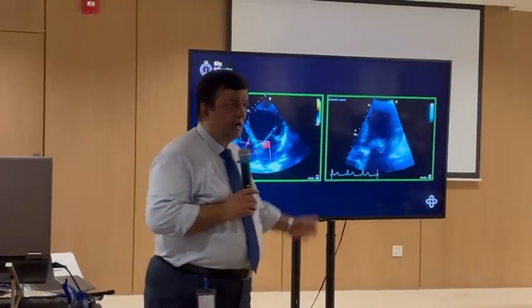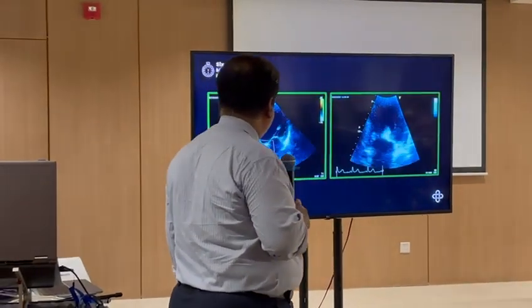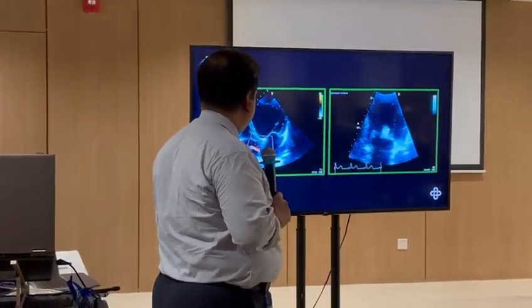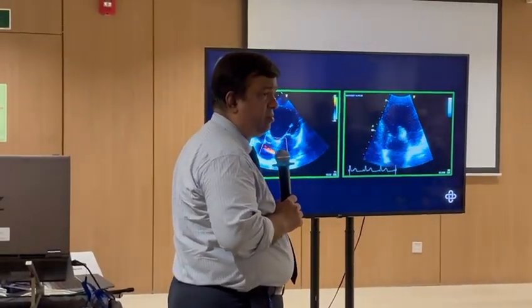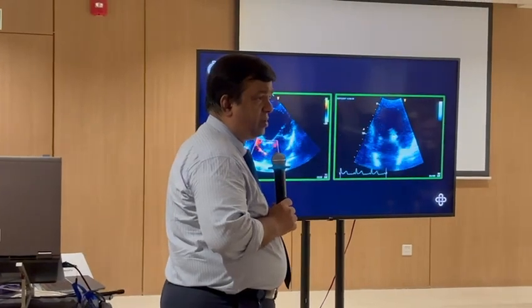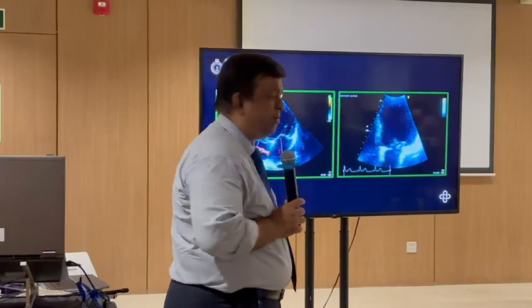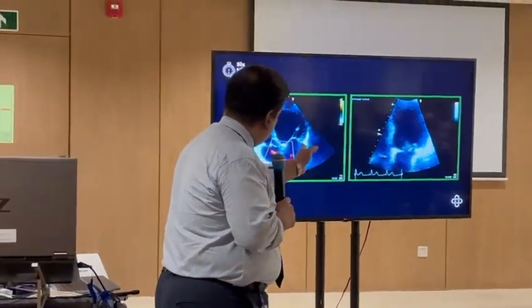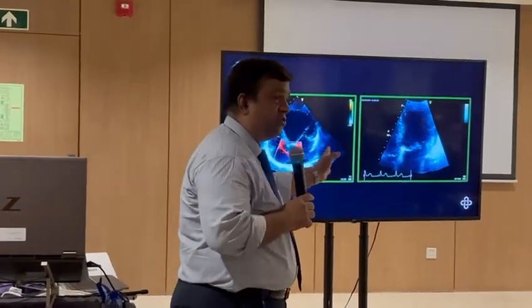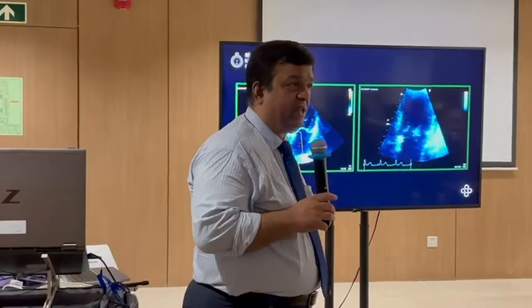Good, moderate, or poor left side. What else do you see there? What's the color showing you? There is an ASD. ASD or PFO? More likely a PFO which has opened because of so much of pressure on the left side. Can you see that? And you can even look at the direction of the flow. The direction of the flow is from the left to right.